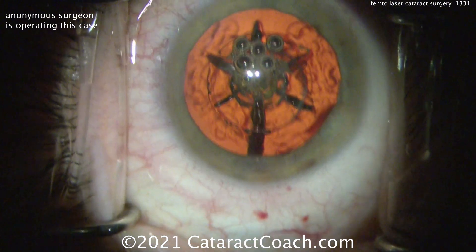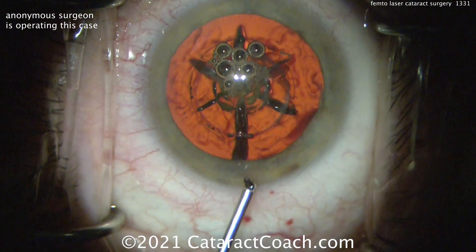That main incision was obviously made with the femtosecond laser. And you can see that main incision is in the peripheral cornea there, not really nicking those limbal vessels.